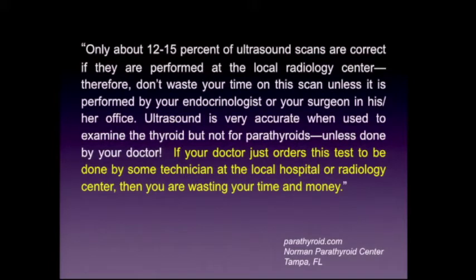Now, this is a quote that I found on the website of the Norman Parathyroid Center in Tampa, Florida, and they do many, many parathyroid surgeries every year, and they do their own imaging. And I found the last sentence to be interesting. They said, if your doctor just orders this test to be done by some technician at the local hospital or radiology center, you're wasting your time and money. And of course, that can be viewed by radiologists as being a negative. Unfortunately, if you don't really pay attention to what you're doing in parathyroid ultrasound, then I'm afraid that's going to be true some of the time.